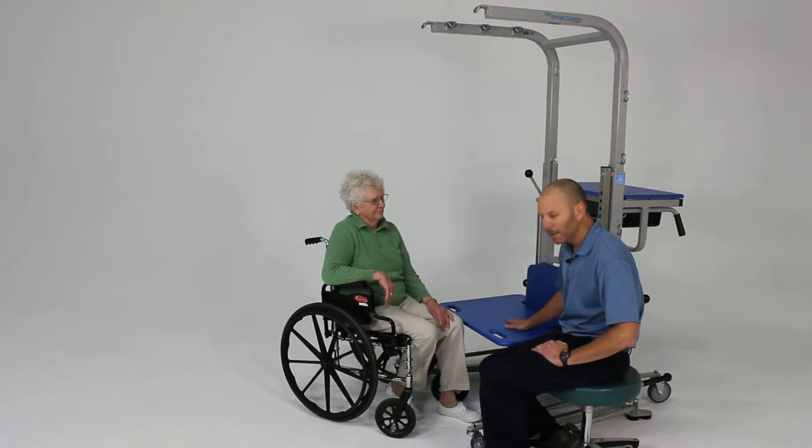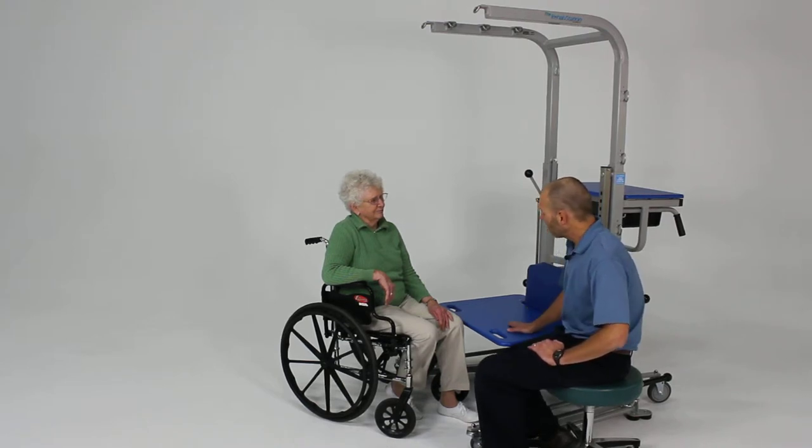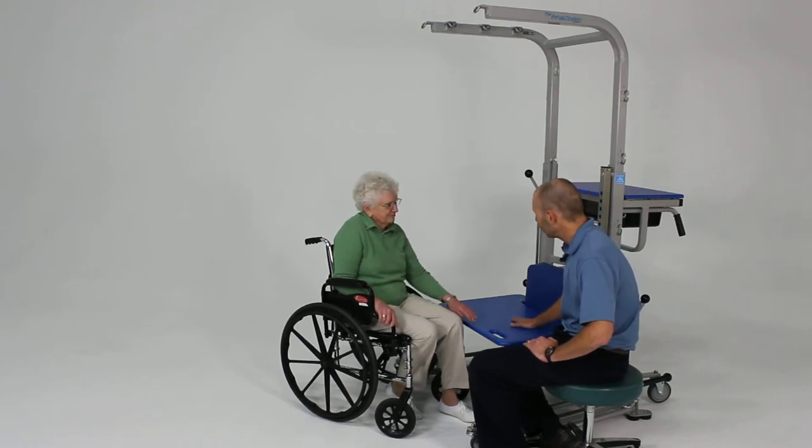This surface also allows the patient's hips and rear to slide fairly easily. So we're going to work on just getting from that wheelchair over onto this surface here.